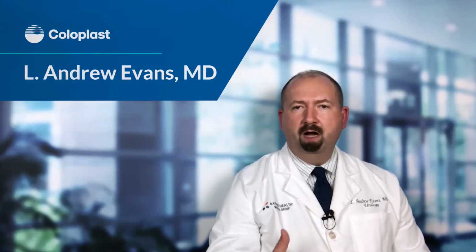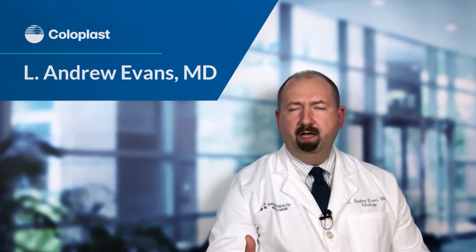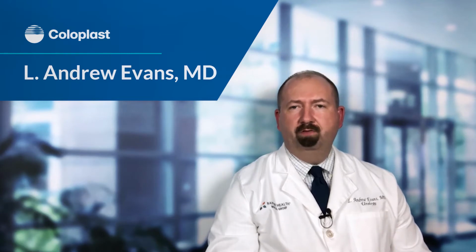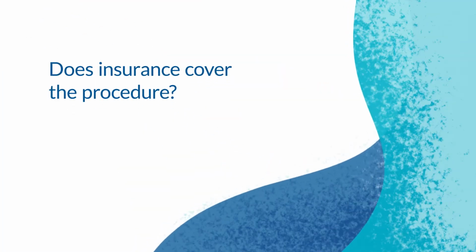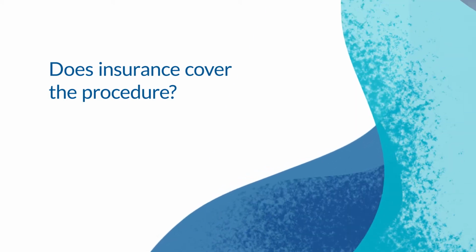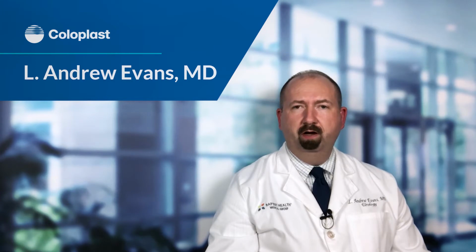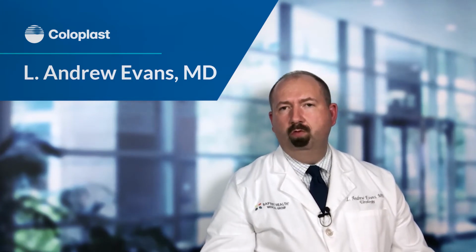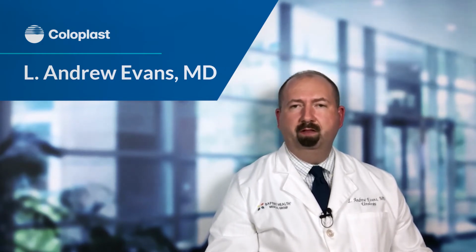Patients who suffer from mild stress urinary incontinence, who may only wear 1, 2, or 3 pads per day, especially after a radical prostatectomy, are excellent candidates for a male urethral sling. Generally speaking, all insurance plans cover treatment for male stress urinary incontinence, as we're generally restoring function that is no longer present and is more of a reconstructive procedure at that point.